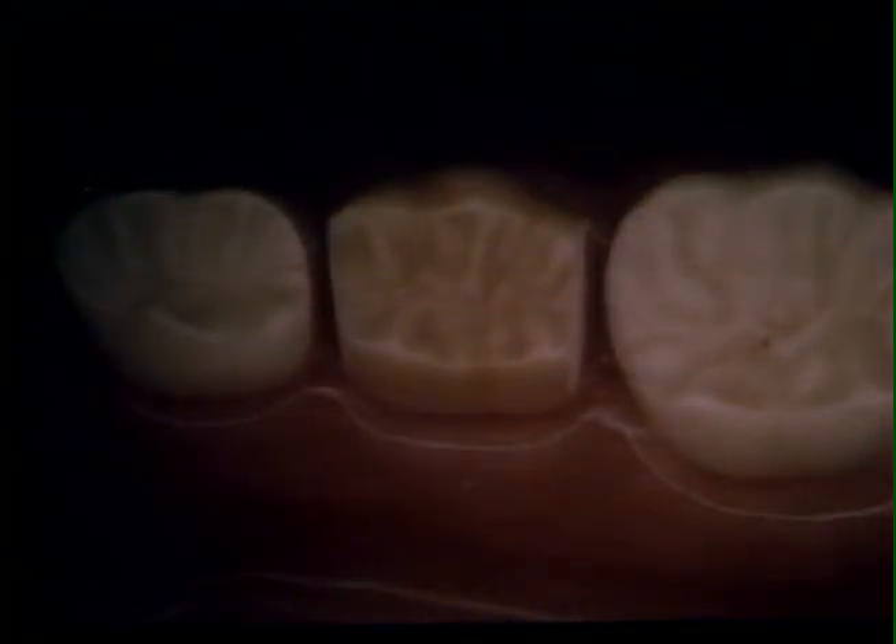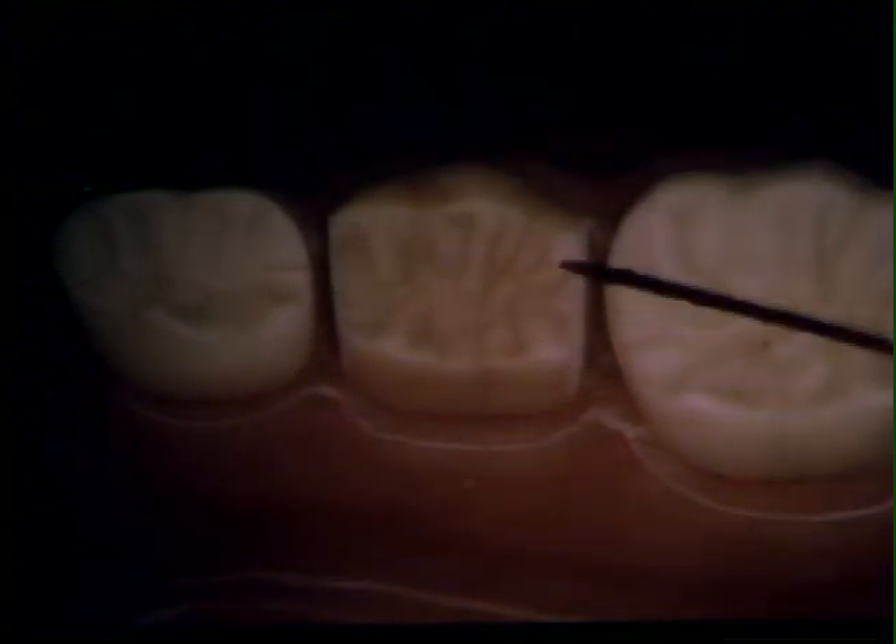This slide shows the lingual convergence of the proximal slices. From the lingual, the size of the slices and their orientation are quite evident. The next step in our preparation is the occlusal reduction. Approximately one millimeter of this surface is removed, so that you have one millimeter clearance with the occlusal surface of the occluding tooth.